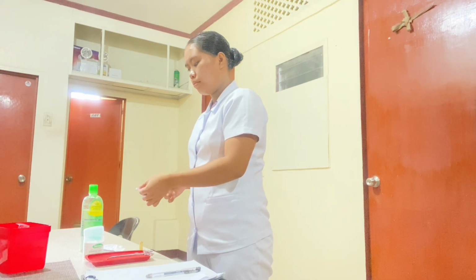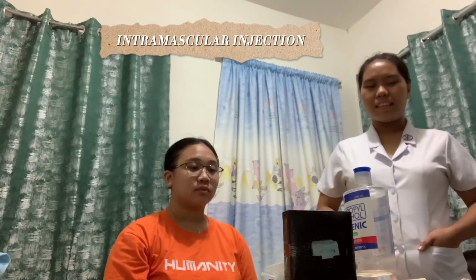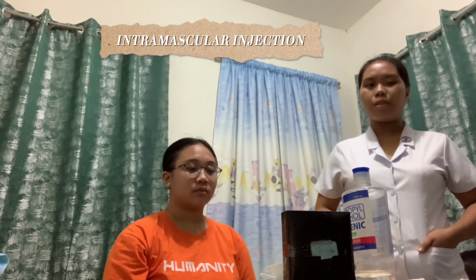It's done. Good day everyone, my name is Grace T. Danyan from BEST 212E. So now I'm going to demonstrate the intramuscular injection. So first is check the doctor's order or the MAR. This is for the legal purposes of the drug administered for the patient.